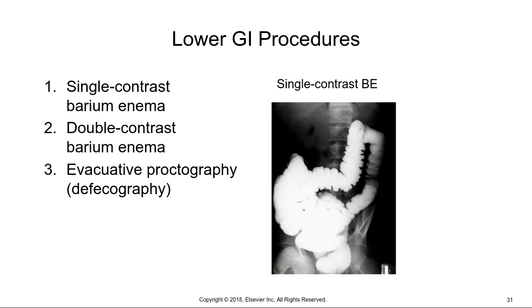and it's not really encouraged that they pass gas to get rid of that. So imagine having a bunch of gas in your intestine and not being able to pass it. Someone telling you, nope, don't get rid of it, hold on to that, let me pump more. Your patients are typically not loving this exam at all.